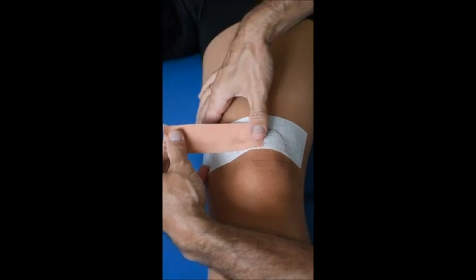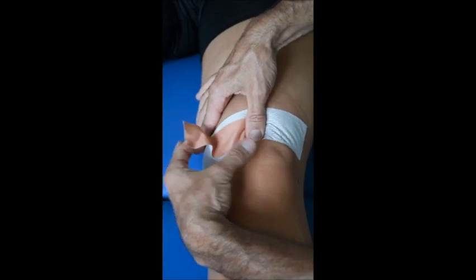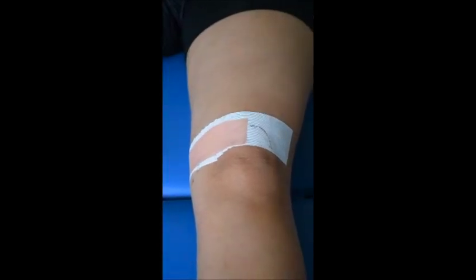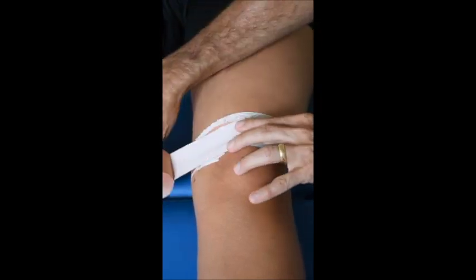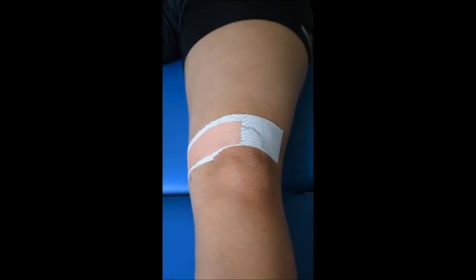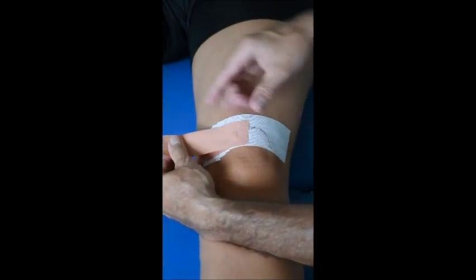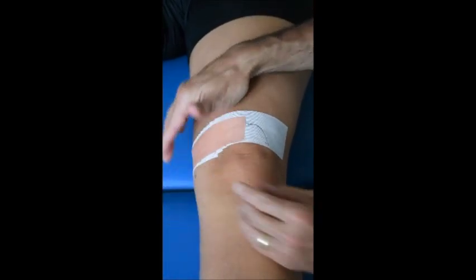We place our thumb over the patella. We will perform this movement so that we lift up the apex and we stick the tape. Make sure you place 2 tapes. For dynamic or for static AP tilt, this is exactly the correction we perform. So again, stick on the upper medial quarter, lift up the patella and stick to the medial side.